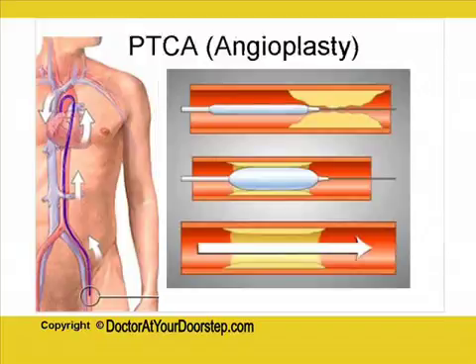The next most important thing to talk about is angioplasty, technically known as PTCA. Once again, on the left side you can see the human figure. There's a catheter which has been placed and has reached the heart, very similar to what you saw earlier in the angiography slide. But here, through the catheter we push a structure which reaches the place where there is the blockage. This structure is a kind of balloon. It can be inflated from outside.